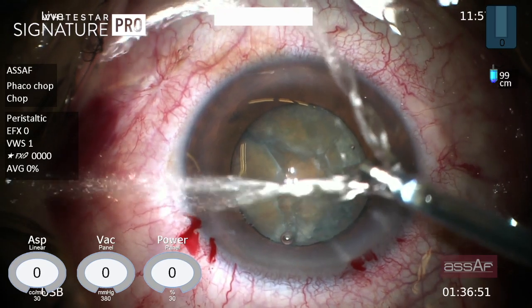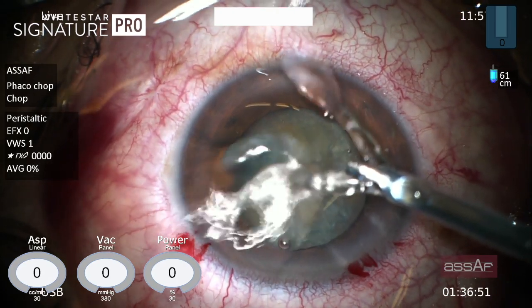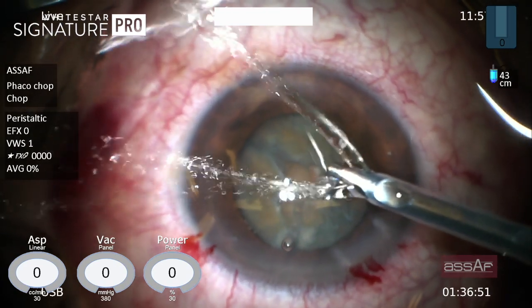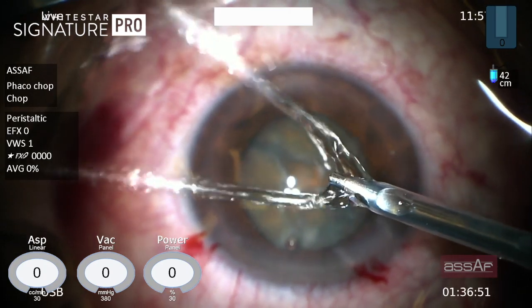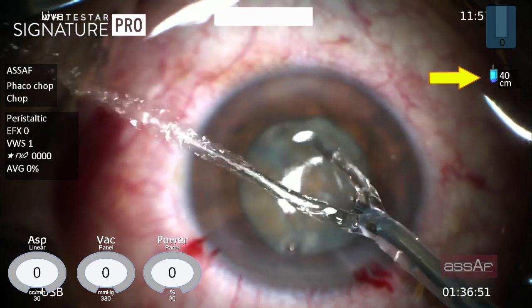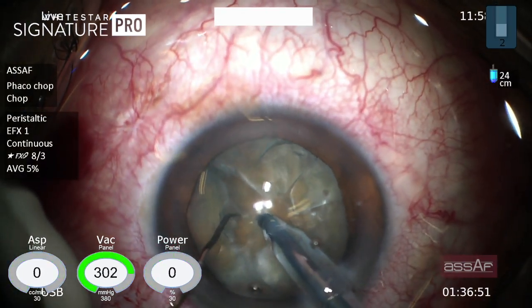Another issue with these cases is zonular laxity. So in order to minimize stress on those weak zonules, reduce the bottle height before entering the anterior chamber. As you can see, I'm lowering the bottle height to only 40 centimeters above the patient's eye before entering the anterior chamber.